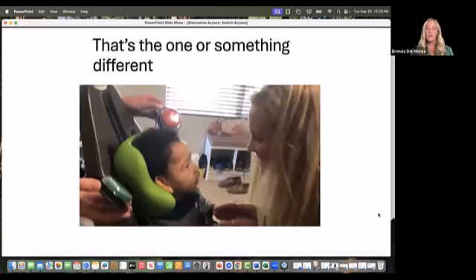So he ended up doing two-step scanning with auditory preview with about 20 on his board. He even got to where he would tell knock knock jokes and sequence through all of that. He was extremely good at switch access. He did pass away at age 8.